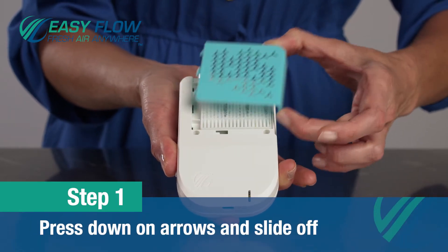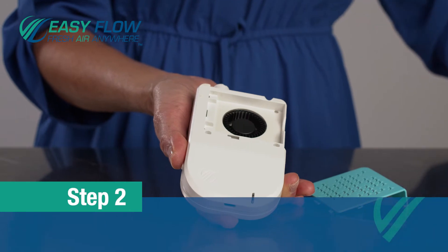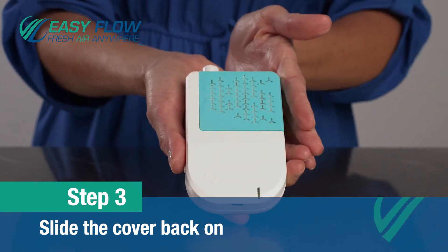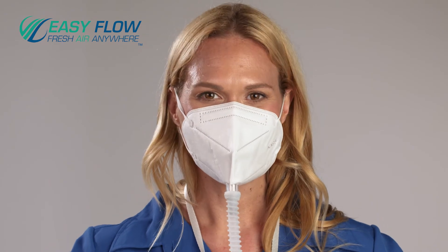Changing the filter only takes a second. Just press down on the arrow and slide off. Replace the filter when it is dirty or airflow is restricted. Once replaced, slide the cover back on. You're now ready to breathe fresh air anywhere. Breathe easy with EZ-Flow.